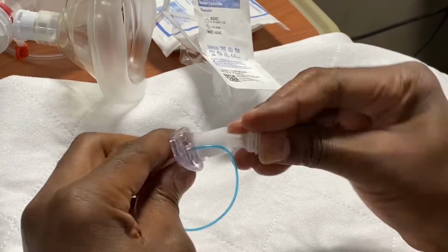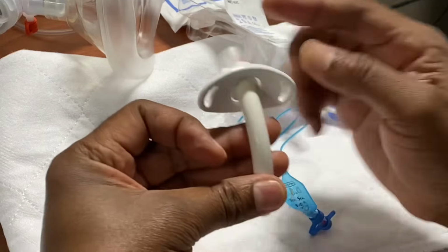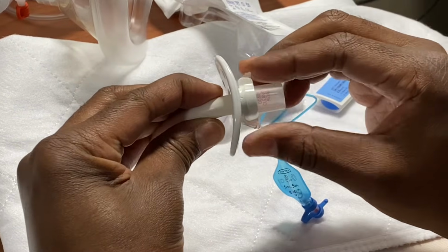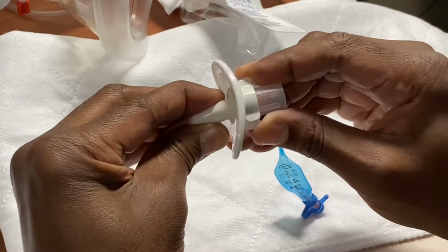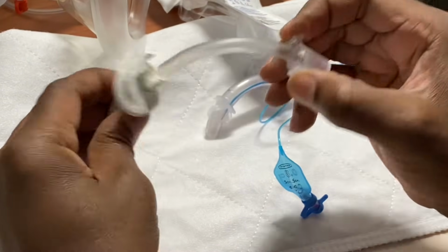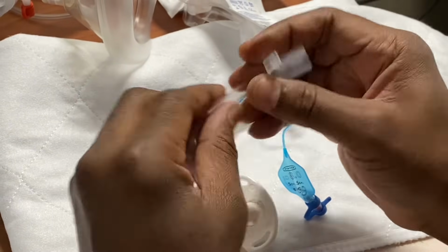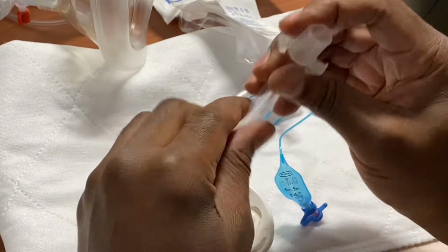The same goes with our Shiley trachs. This is a Shiley, again, non-fenestrated, and this clips. So you undo the clips, you squeeze them together, and it comes out. Same thing when you go in. And the same thing with the inner cannula. It's bendable. It's disposable. You can squeeze it. It's flexible. So that makes it disposable.